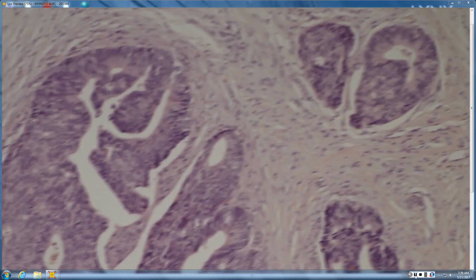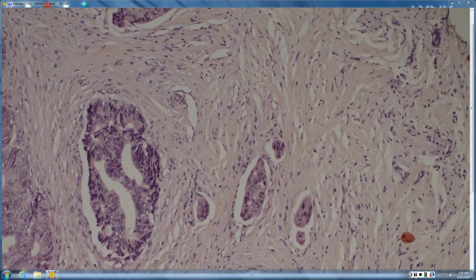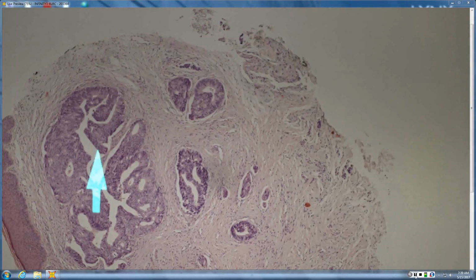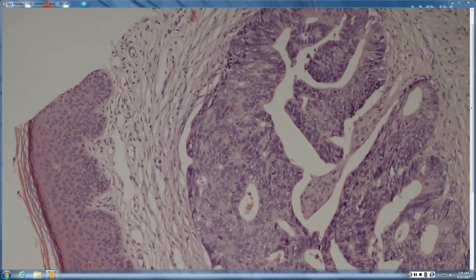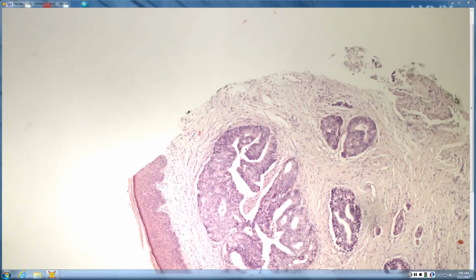Okay. So yeah, we have a dermal-based lesion. We're obviously talking about metastasis, multifocal. Kind of like they're punched out in some areas. So you wonder about, could it be breast, could it be a thyroid, some kind of adenocarcinoma. Yeah, it certainly looks glandular, right? Glandular and kind of high columnar, right? Maybe a little more stretchy than breast usually is. Yeah, some areas maybe vascular. And you get a hint of dirty necrosis in the center. And then this one proved to be colon.